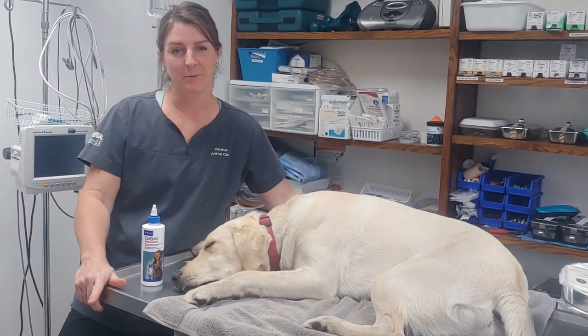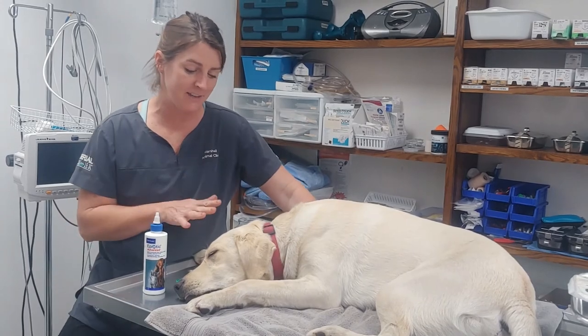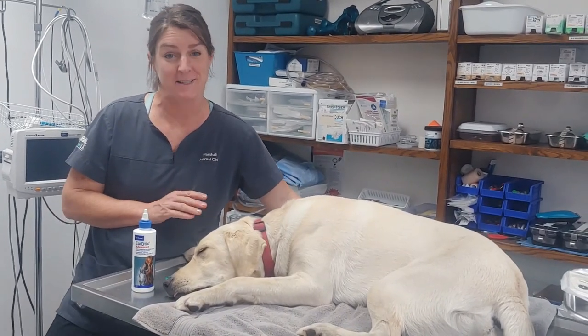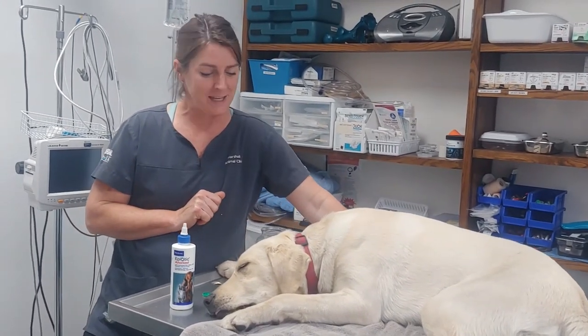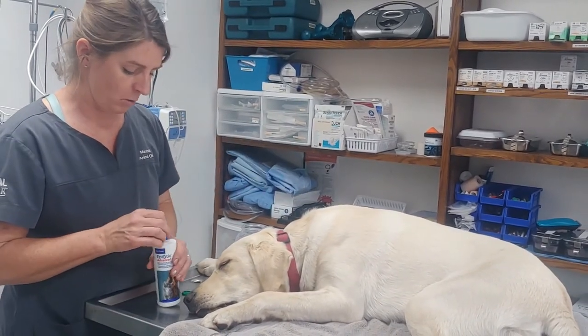Hi, we're here with Wrigley and we're going to demonstrate an ear cleaning and how to medicate ears. I know I have the advantage of him being sedated — he's about to be neutered. He's had a pre-anesthetic, but he's still awake enough to know what we're doing.